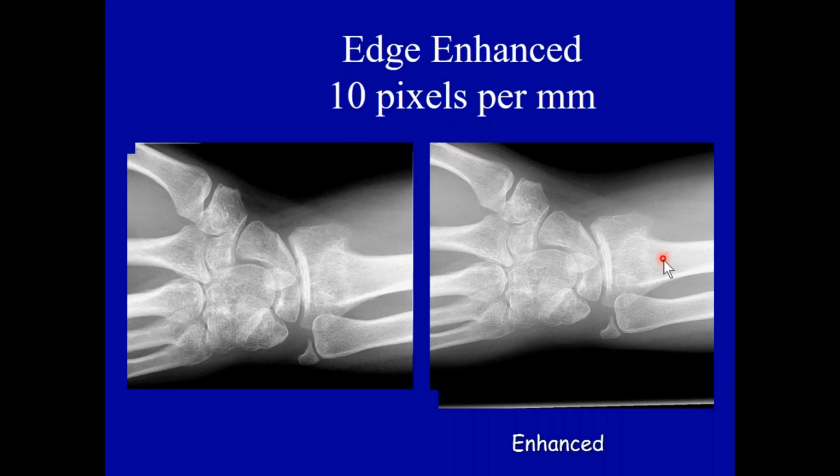He's now able to see more relative to our basic densities, air, fat, bone, and water, and so on. So the better the software and the digital system is, the more things we can see, and that should alter our methods of treatment for the patient.